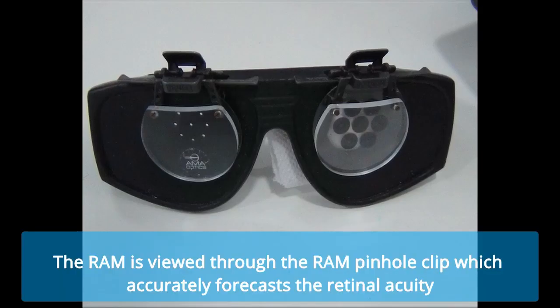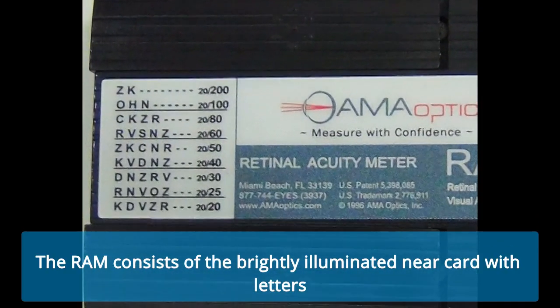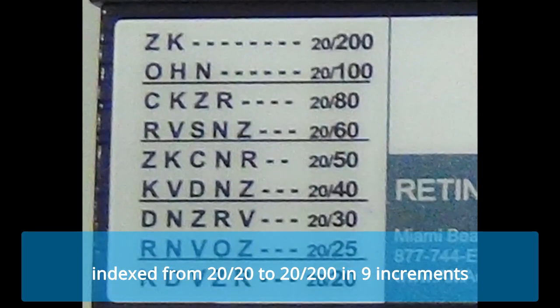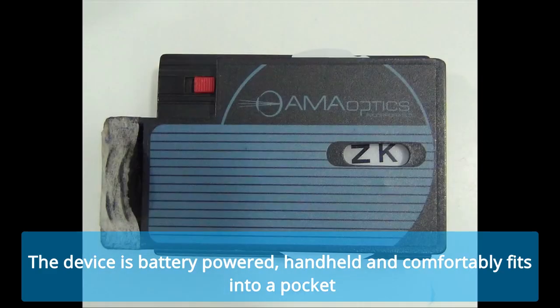The RAM is viewed through the RAM pinhole clip, which accurately forecasts the retinal acuity. The RAM consists of a brightly illuminated near card with letters indexed from 20/20 to 20/200 in 9 increments. The device is battery powered, handheld, and comfortably fits into a pocket.